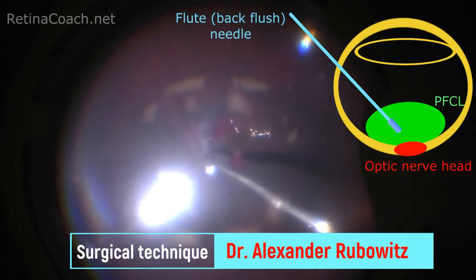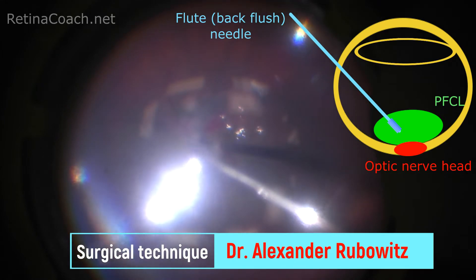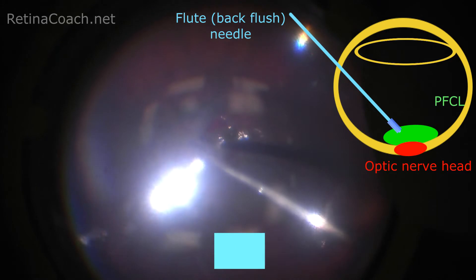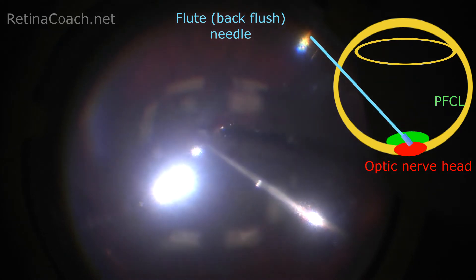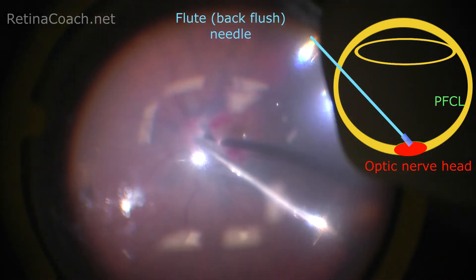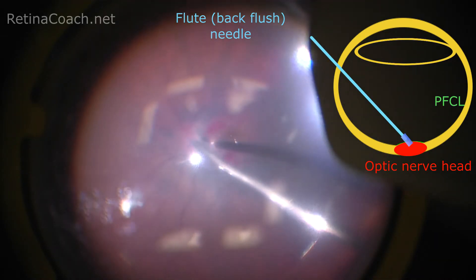During removal, the tip of the cannula should stay inside the PFC bubble, and when almost all PFC is removed, stay with the soft tip in a safe area above the optic nerve head or nasally to it. The soft tip should not be pushing the tissue to prevent damage.